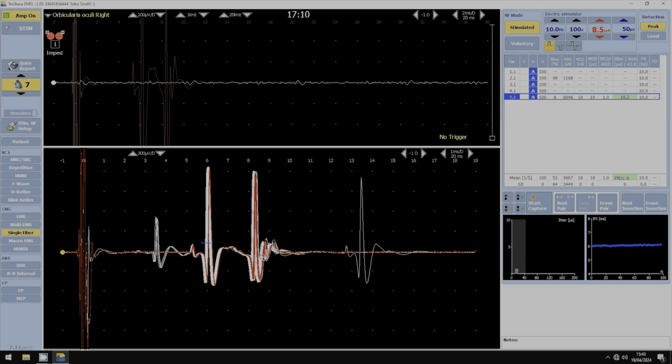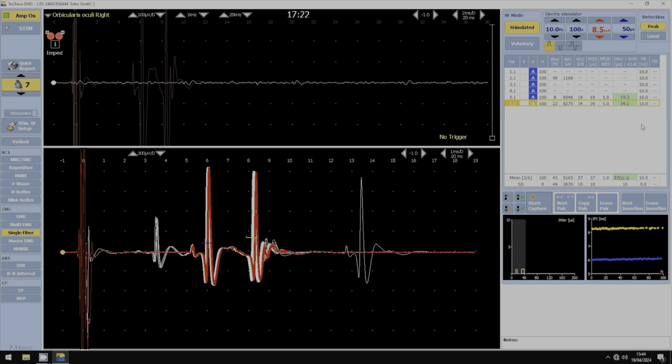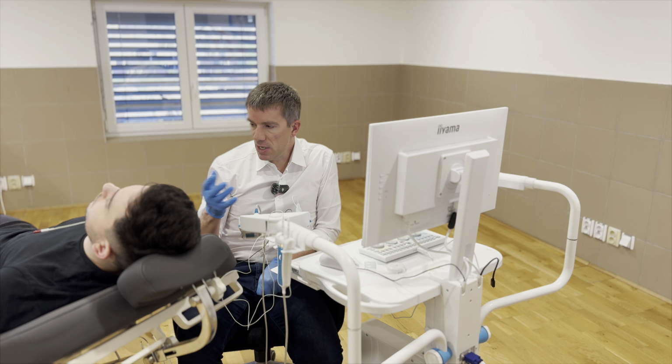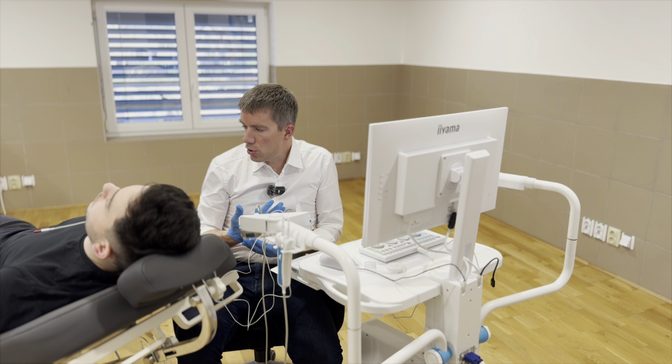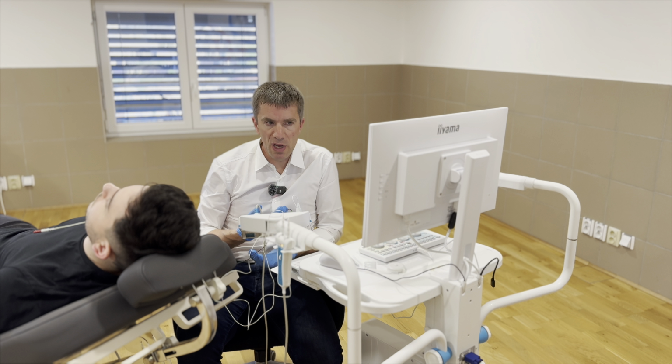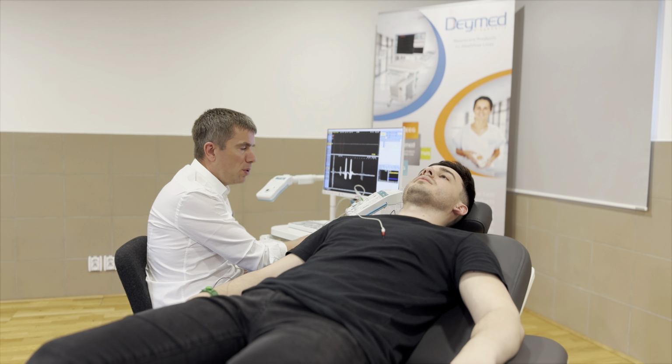Now in the same measurement we have another pair, so I can do the next pair and put the yellow cursor on this second pair. I see that the jitter is 34 for this pair. For individual recordings, depending on the needle and the filter settings, we need the right reference values, but for individual jitter pairs, sometimes this can still be a normal value in stimulated single-fiber EMG.